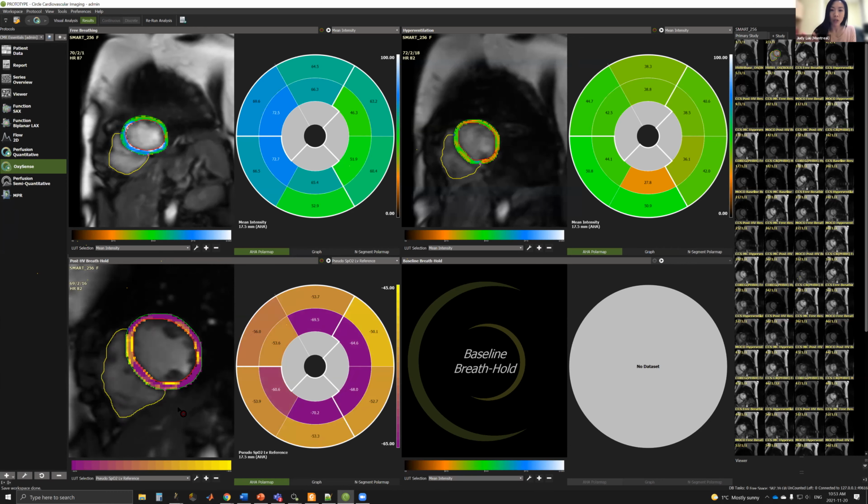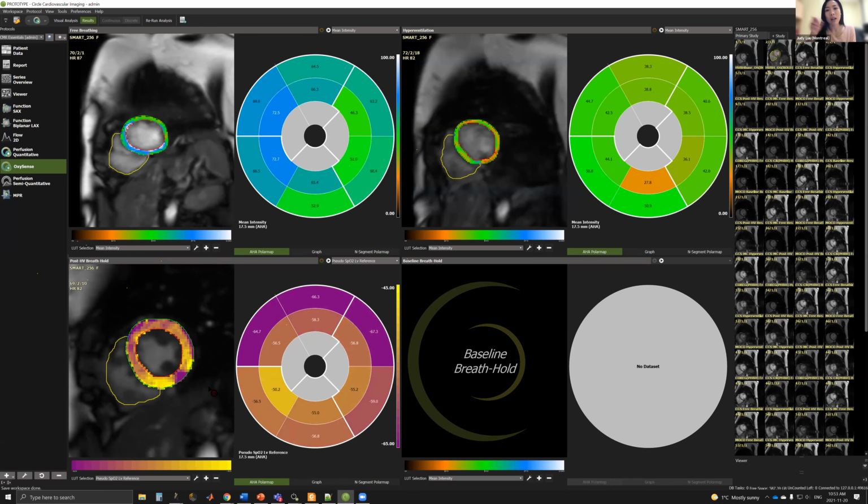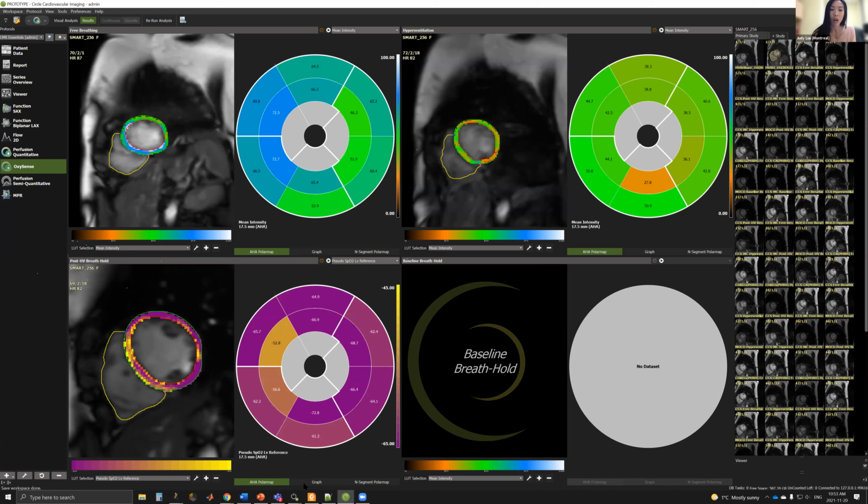So after doing all of the experimental analysis, the basal-mid and mid-apical slices are likely the highest bang for our buck. And if there is going to be a significant amount of ischemia or microvascular dysfunction or reduced or blunted oxygenation, it's likely not going to be just in that apical region. It's going to be some sort of coronary territory or heterogeneous throughout the myocardium.